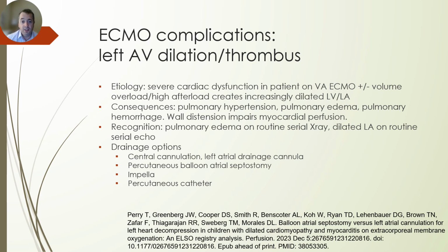So the etiology of this is severe cardiac dysfunction in a patient on VA ECMO with high afterload, resulting in an increasingly dilated left ventricle and left atrium. The consequences of that are pulmonary hypertension, pulmonary edema, pulmonary hemorrhage, and wall distension impairing myocardial perfusion.